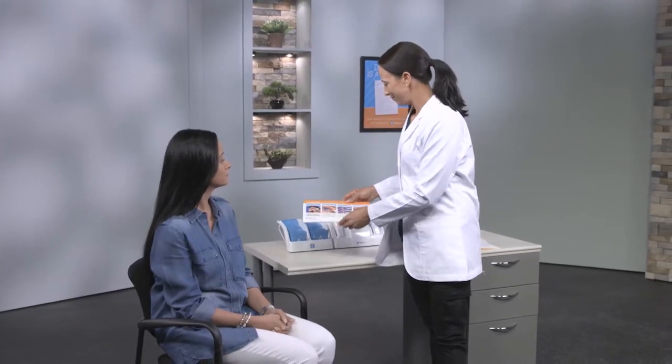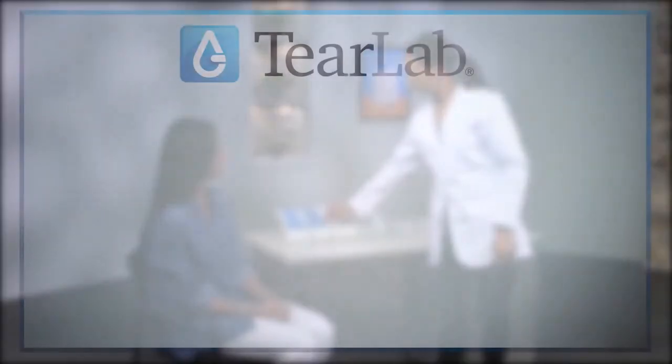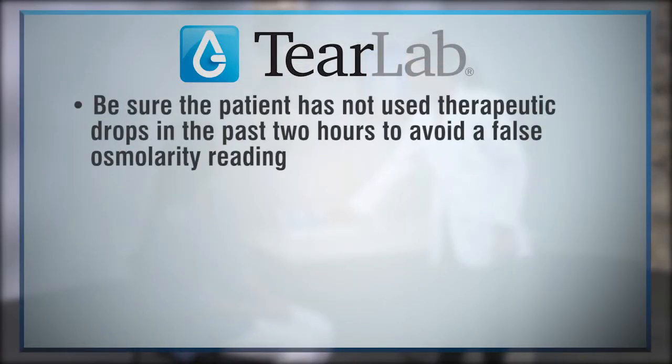After explaining the procedure to the patient, you are now ready for patient testing. Be sure the patient has not used therapeutic drops in the past two hours to avoid a false osmolarity reading.